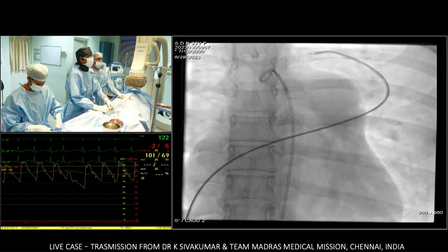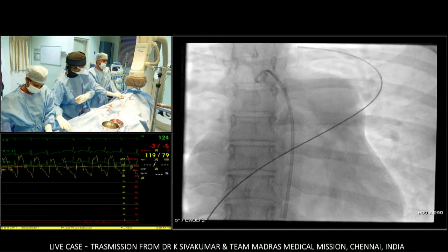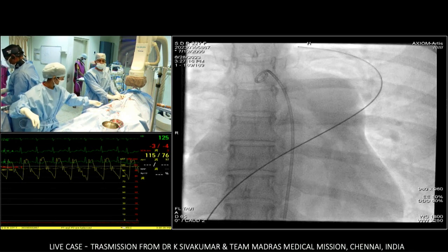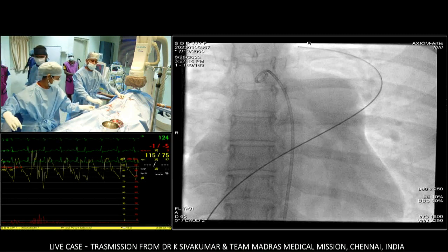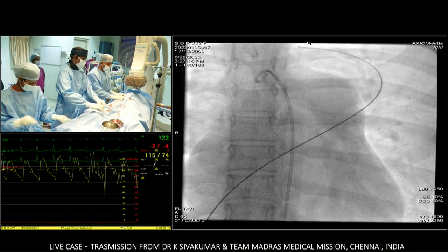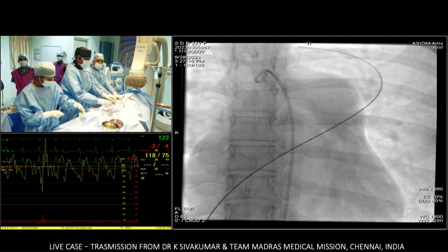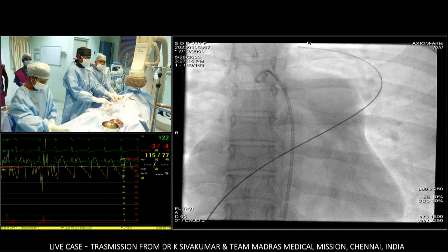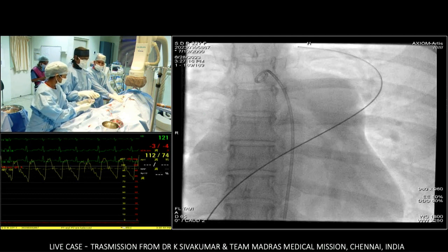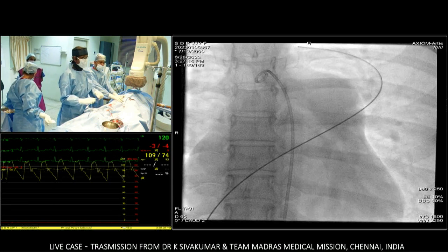The patient is conscious. She is breathing on her own. Shiva, just a practical question. Before starting the balloon occlusion test, what would you expect? What are the differences or variations that you would expect, to carry on to close the defect with an ordinary device, to put a fenestrated device, or give up? There are three options you are facing. Correct. Mario, from the previous data itself, we have information that tells us that we are okay to close this ASD with a fenestrated device.